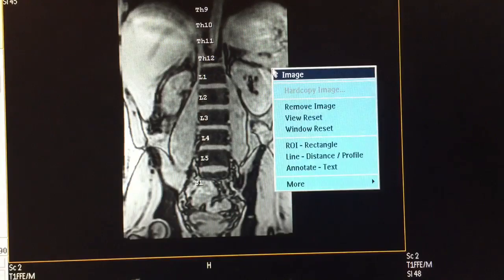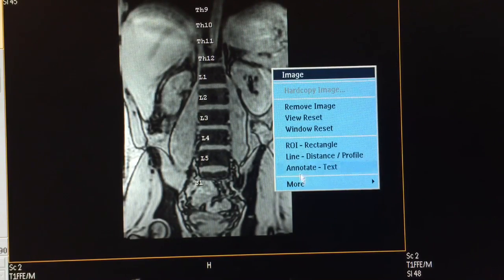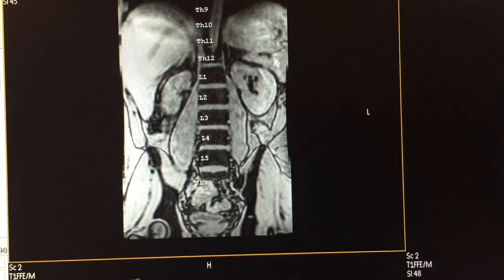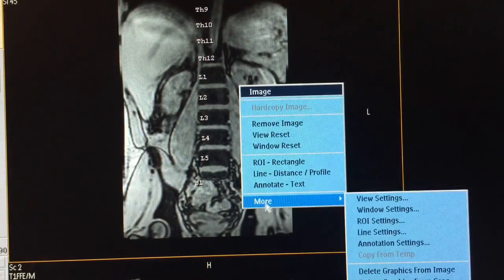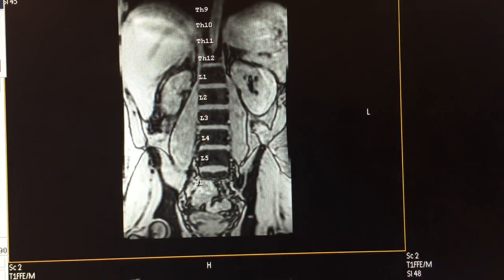Zoom out and go to line distance profile. We already have the angle highlighted, but we need to delete it and go back to more options, select line settings, and select the angle option again to get an approximate angle.